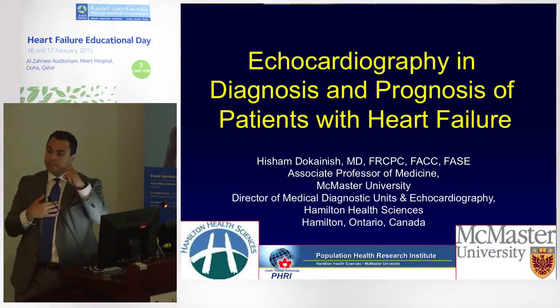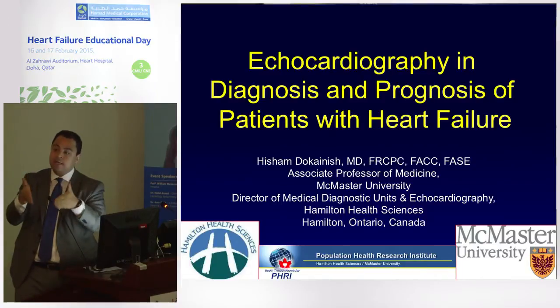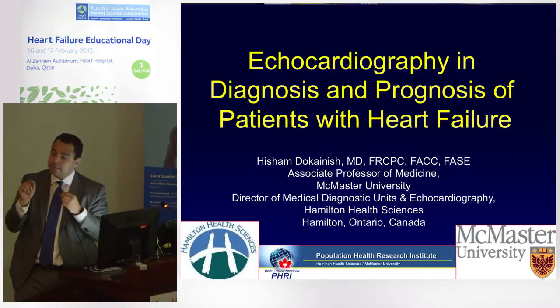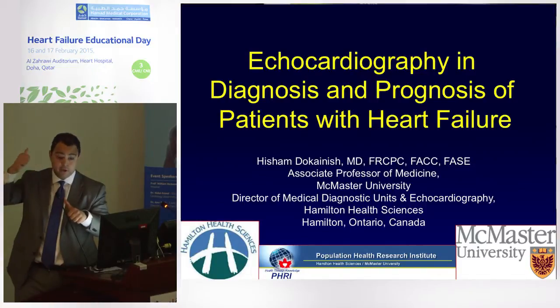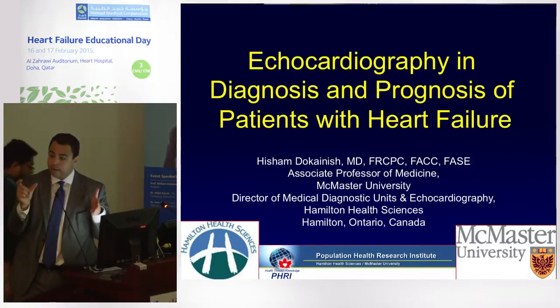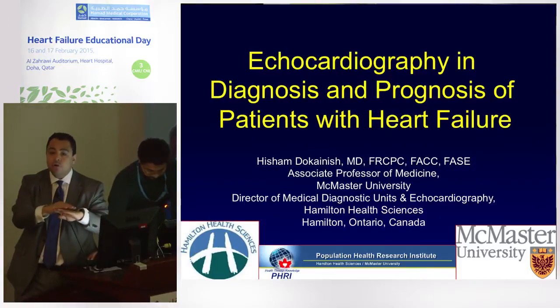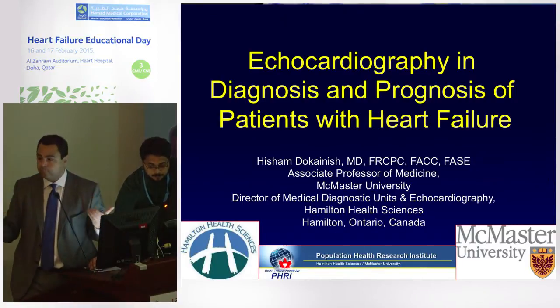If your peak E wave velocity is less than 50 centimeters per second and your A wave is high, at that instantaneous moment in time, your LA pressure is exceedingly likely to be normal. So I would say, A, make sure that your assessment of symptoms is at the same time as your Doppler acquisition. It's not 3 days ago when they could have been in heart failure. And B, make sure there's nothing else causing their shortness of breath. There are a lot of little old ladies running around Hamilton, Ontario, Canada, who have grade 1 diastolic dysfunction, who have LV hypertrophy, who are short of breath, but have no other symptoms or signs of heart failure. They may have COPD, pulmonary fibrosis, whatever it is.